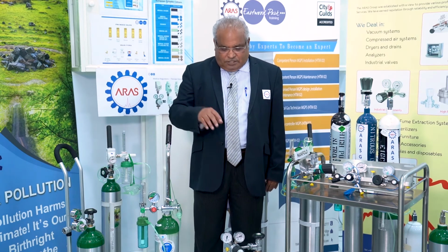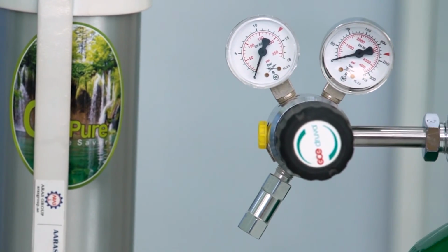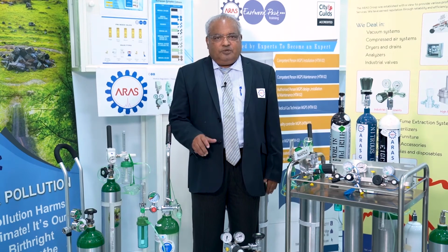When you talk about the multi-stage regulator, which we are seeing here, one advantage is that you can see the oxygen content inside the cylinder that is delivering oxygen to the patient.